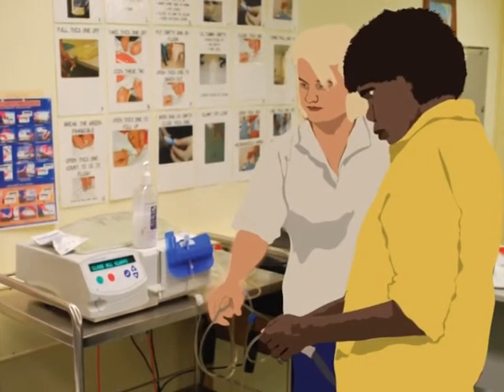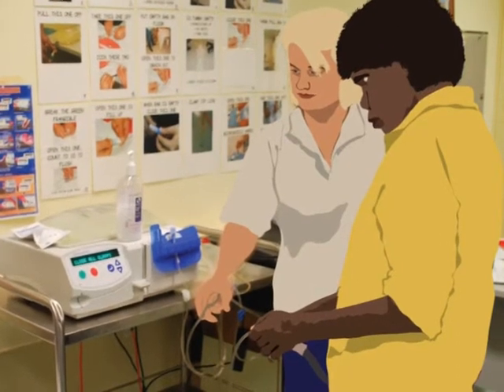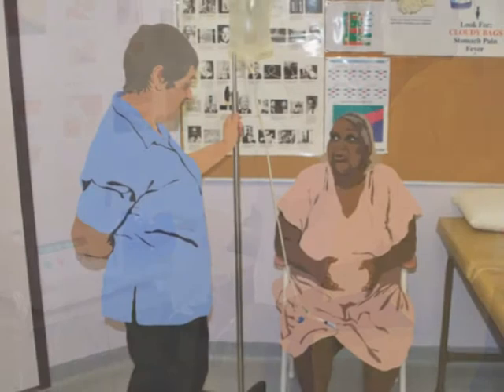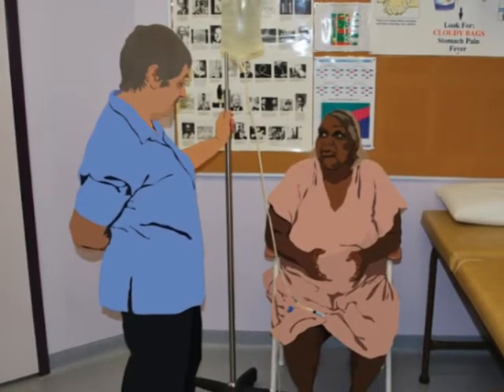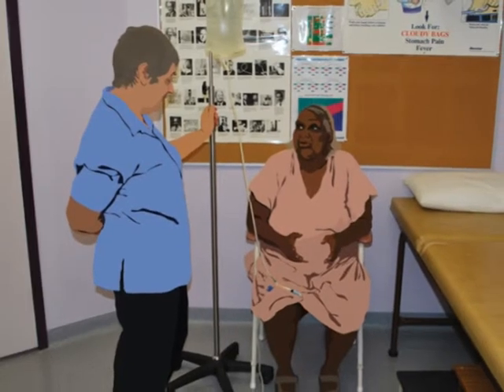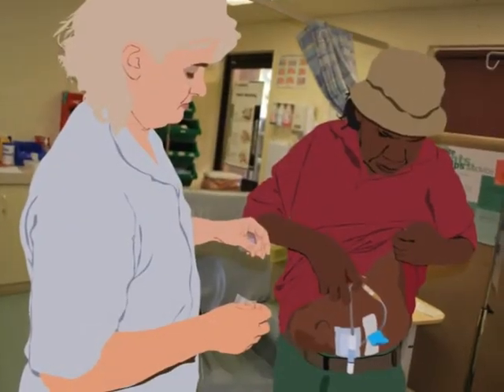You will do your training at the PD clinic. The PD nurses will teach you how to do your PD and look after your catheter and tube.